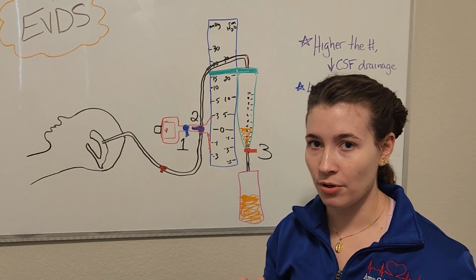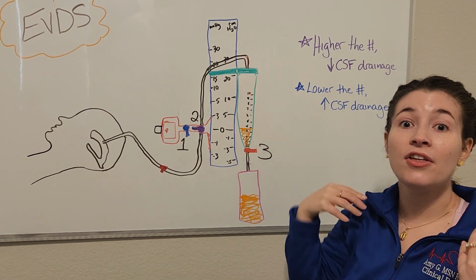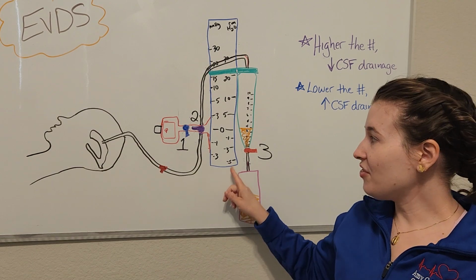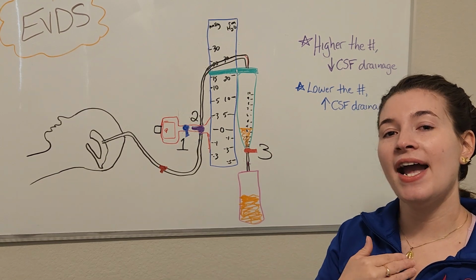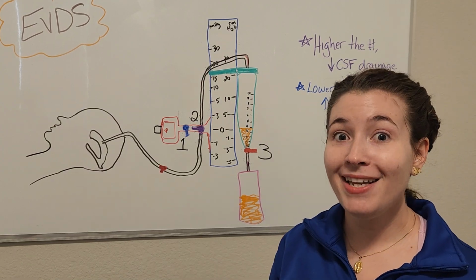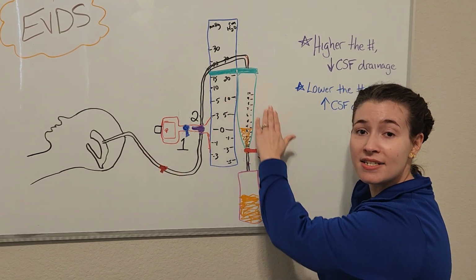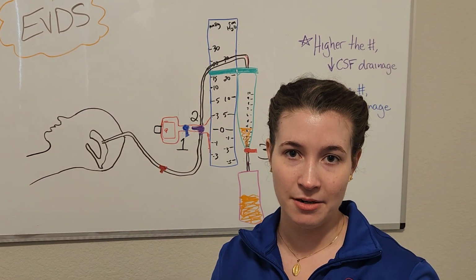Now, this is a very important principle with the EVD drain. The higher the number that we set the drain to, the less CSF drainage there will be. The lower the number that I set it to, the more CSF drainage there will be. And what this number represents is an ICP reading. So for instance, if I have orders to set my drain to 10 centimeters of water, what that means is anytime the patient's ICP reading gets above 10 centimeters of water, it's going to promote drainage of CSF into the buretrol until the patient's ICP gets back to 10 centimeters of water.